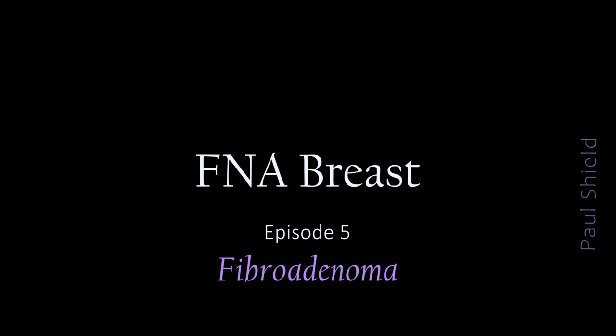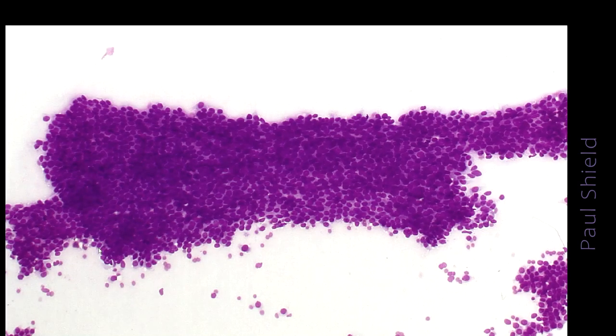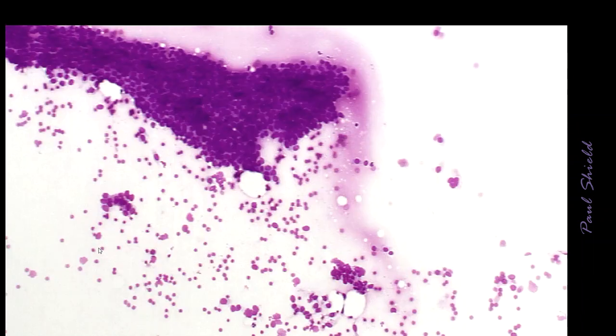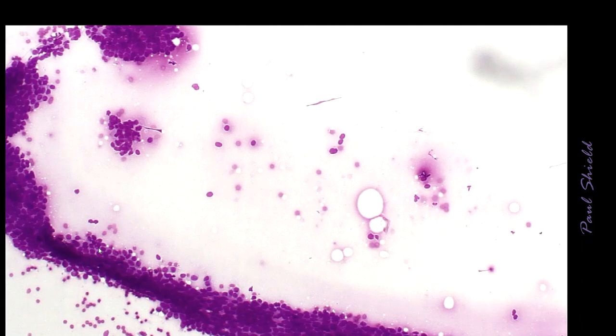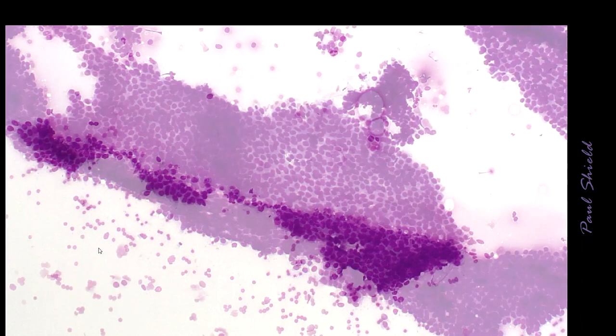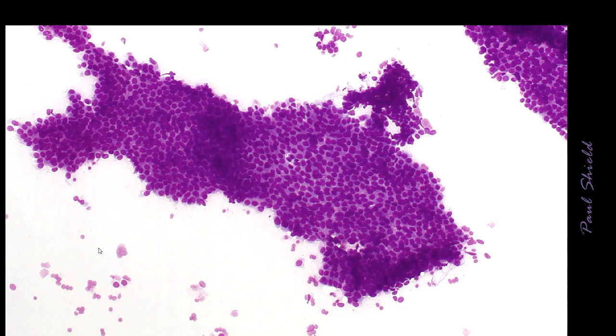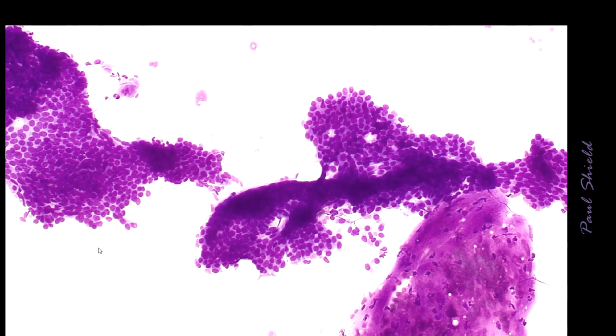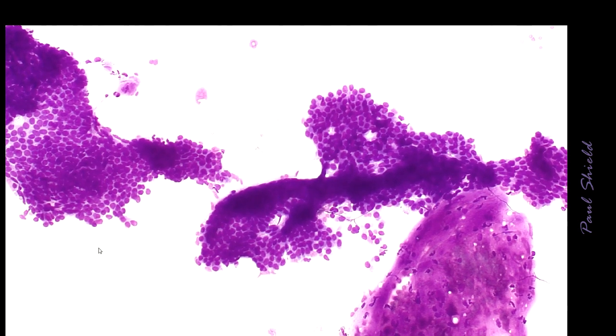Let's look at fibroadenoma in breast FNA specimens. This is the most common benign tumour and probably the most common cause of false positive diagnoses. These are highly cellular specimens. I'll give you an overview of this case to show you just how many epithelial cells are present. Notice, however, that they're all present in very cohesive, large groups of cells.